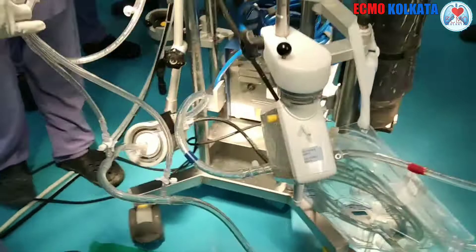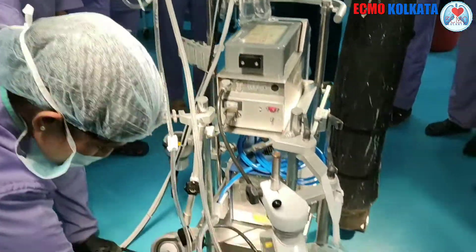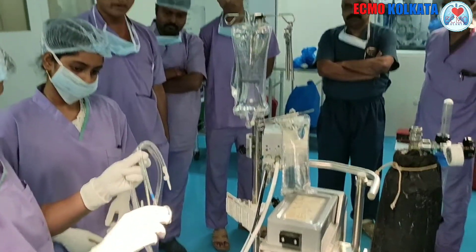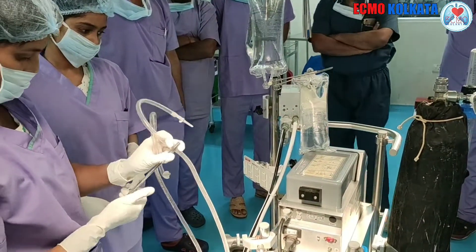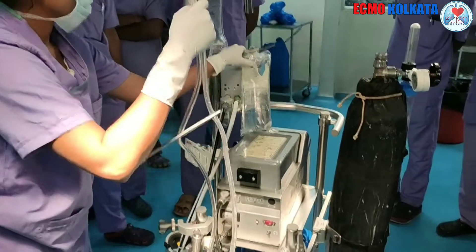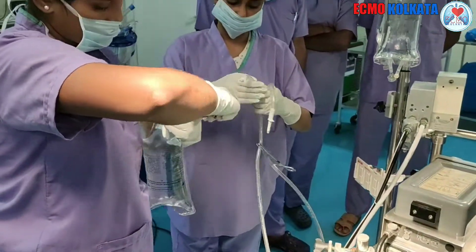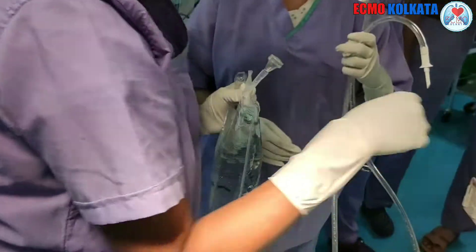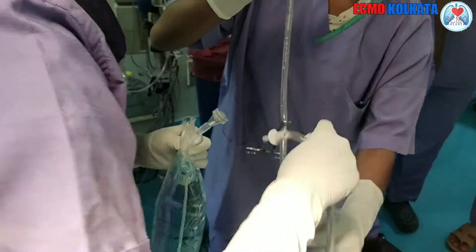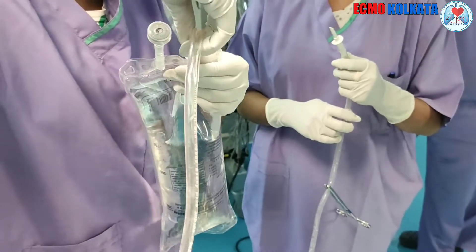We generally prime our circuit with one liter of NS pouch. The one liter pouch is enough for priming the whole circuit. The priming tube should be clamped. After that, we have to connect the priming tube with the NS pouch one by one, and it should be connected carefully so that there should not be any leakage.